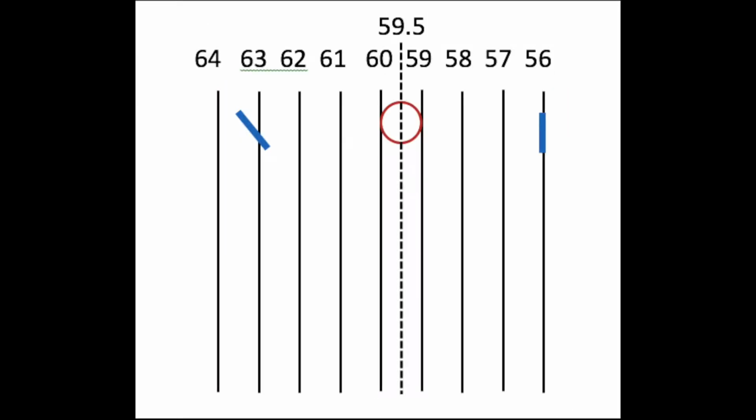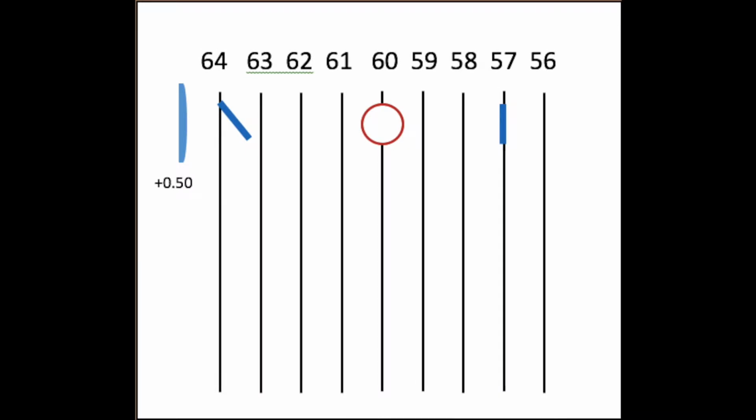Using this value as a basis, the two focal lines can also be taken into consideration. Here are the two focal lines, with the circle of least confusion not on the retina. To perform the Jackson Cross Cylinder, we must use a spherical lens, as seen here. Once the circle of least confusion is on the retina, the JCC can be used. The Jackson Cross Cylinder has three main steps: power acceptance or power search, axis refinement, and power refinement.